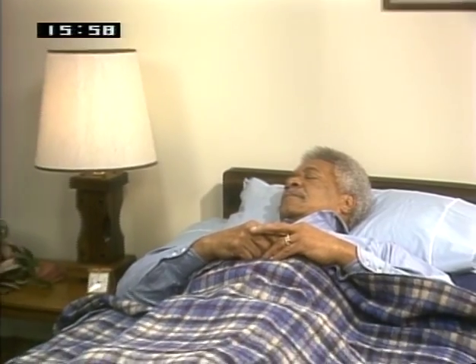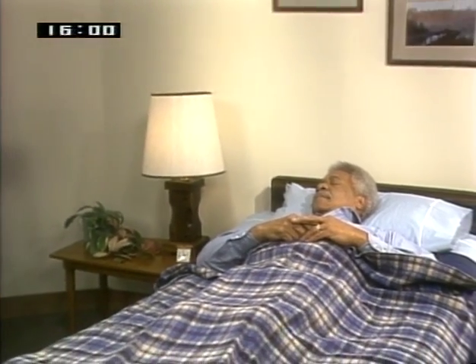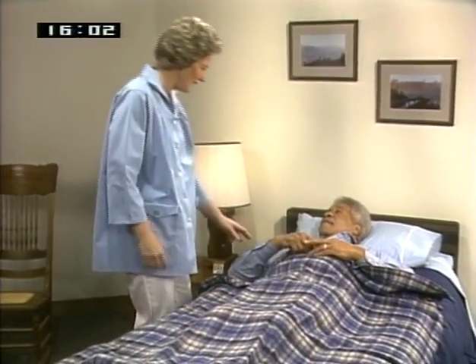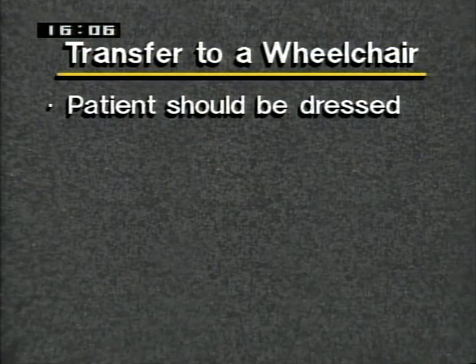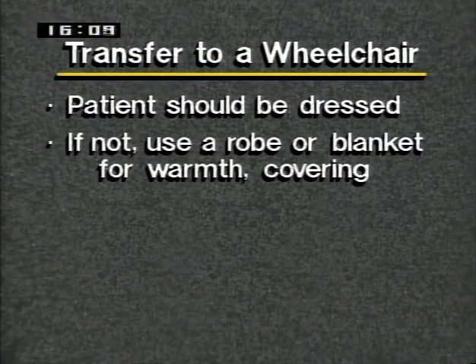Tom has had lunch, been visited by the physical therapist, and had a short afternoon rest. He has a doctor's appointment, so Judy will help him transfer into the wheelchair. Tom is fully dressed. However, if your patient is in nightclothes, use a robe or blanket for warmth and covering while he's sitting up in the chair. The wheelchair is a very valuable means of transportation for many people, but again, there are some precautions.